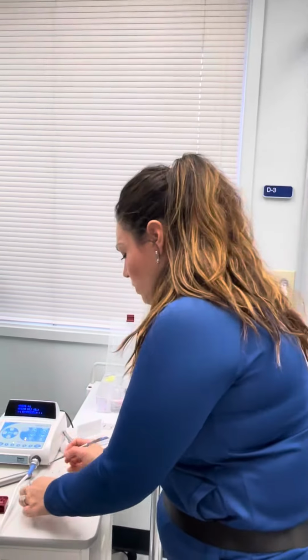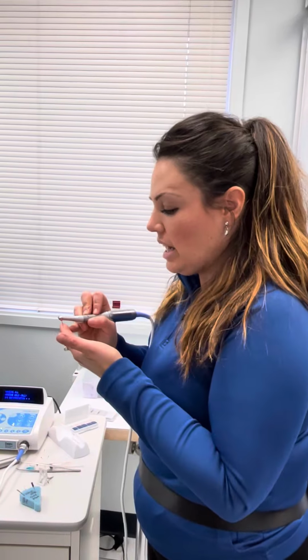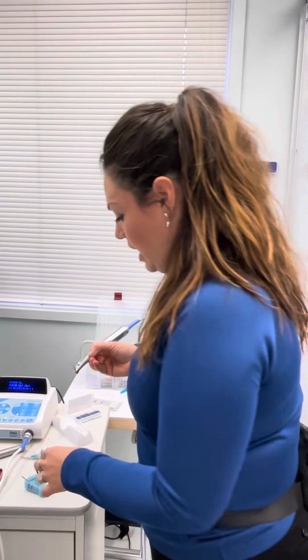Or at that point, maybe you want to go up a size if you felt like your flutes didn't have any debris on them. So like I said, as the doctor is doing this, he's inspecting his file, making sure that he has perfect wind, not stretching, not anything. If you see stretching or unwinding, that's the next step to separating the file. So even if you're like, I just have a little bit more, let's go ahead and get a new file. A separating file is like the worst day in endo.